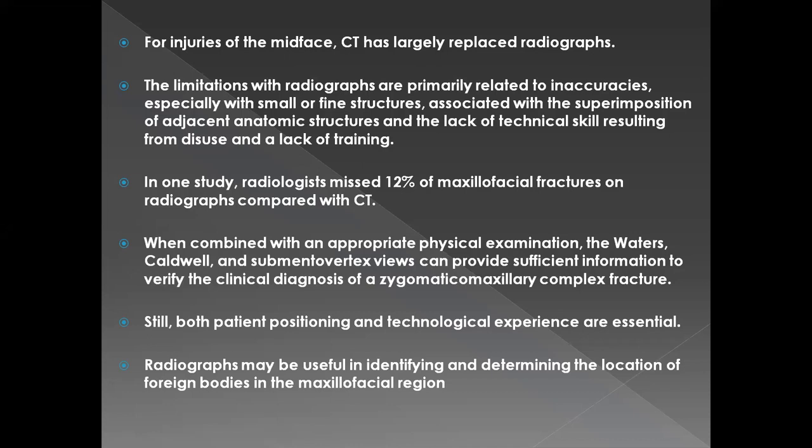This is the only case in which a radiograph is better than CT, because in CT, when you are coming across a maxillofacial trauma patient where you're suspecting foreign bodies, like a patient has had a firearm injury. So that firearm, basically a bullet lodged in the maxillofacial region, you know, a bullet is made up of metal. So metal, whenever you do a CT scan of an area which contains metal, that metal actually produces some artifacts which make it very difficult to interpret that CT scan.